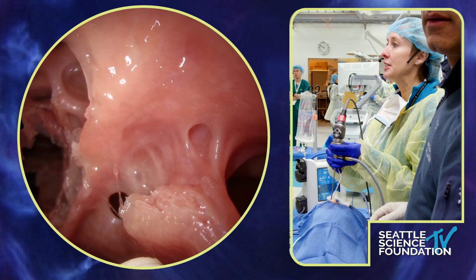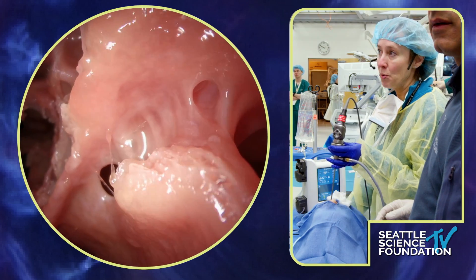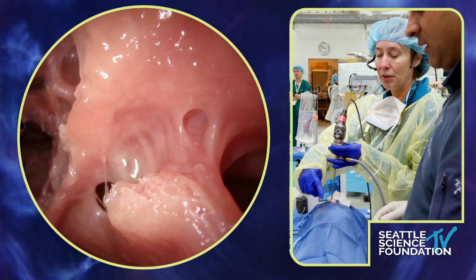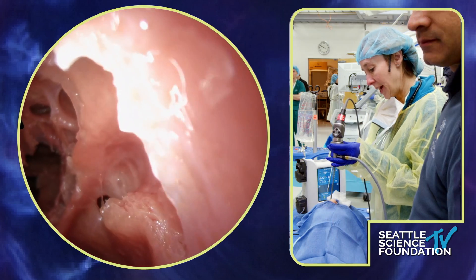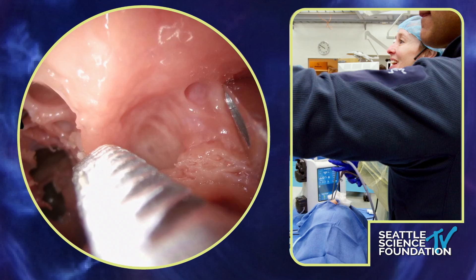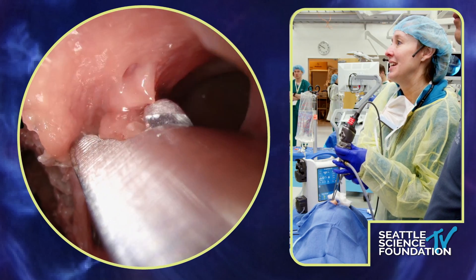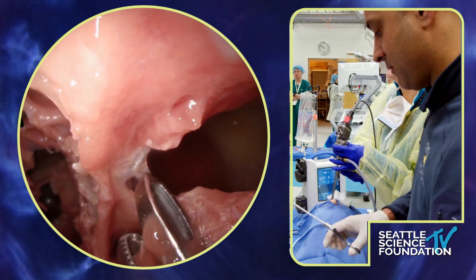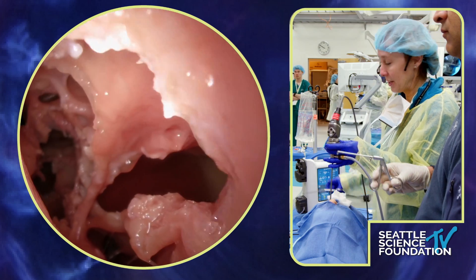What we do is leave all of this anteriorly alone just so you're not disrupting the mucosa. As far as mucociliary clearance is concerned, we're just going to widen this posteriorly. Normally I would use a curved turbinate scissor, but we don't have that, or an up-through cut, which we also don't have. So we're making do with the straight through cut. I'll twist my hand into that space and with sharp dissection connect that to that accessory ostia, enlarging it posteriorly.